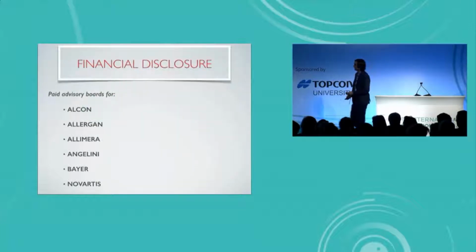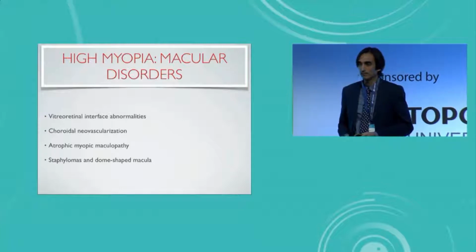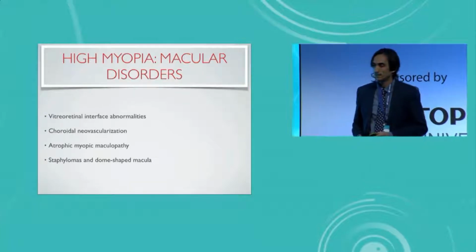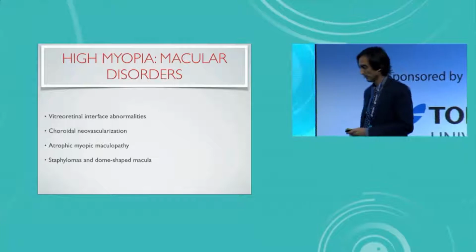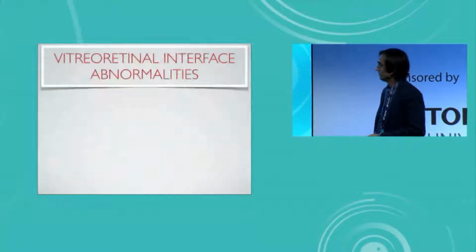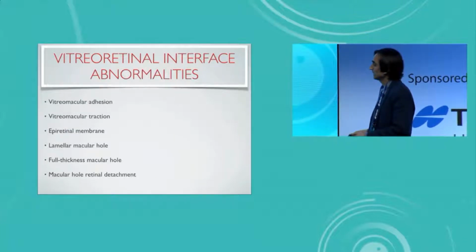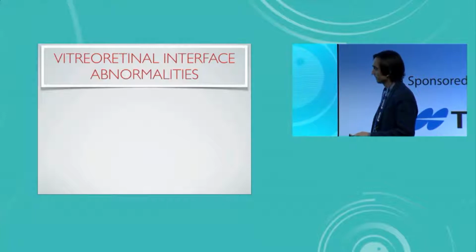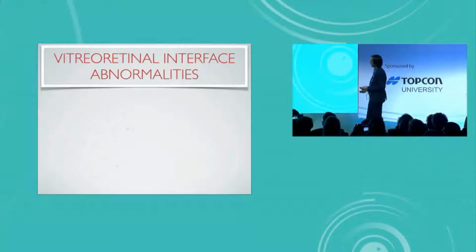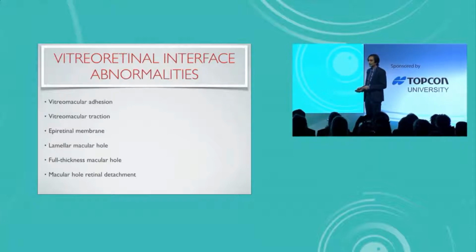We know that macular disorders are relatively common in high myopes, such as presented by my previous speakers, but I'm going to focus on vitreoretinal interface disorders. Mainly vitreomacular adhesion, vitreomacular traction, epiretinal membrane, macular holes, lamellar and full thickness, and macular hole retinal detachment.